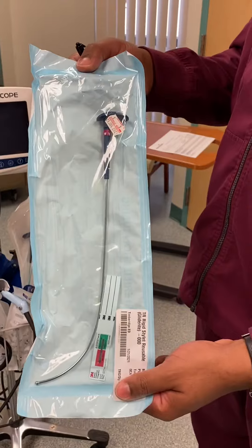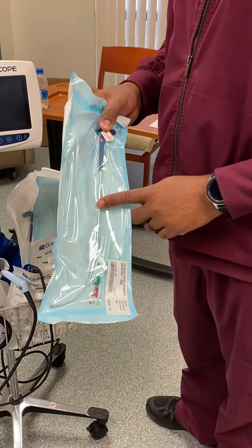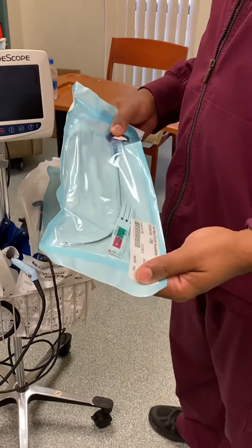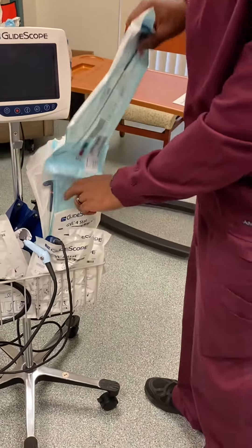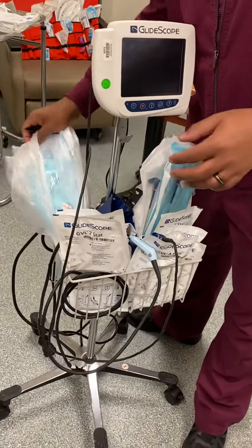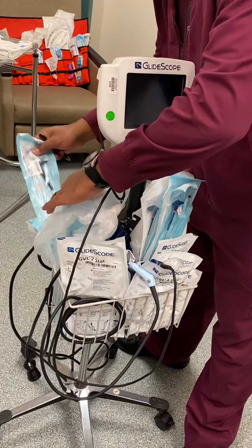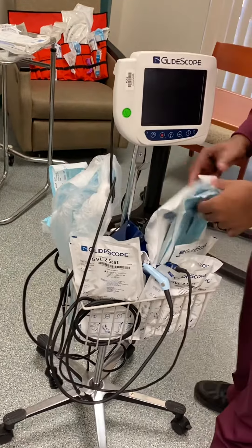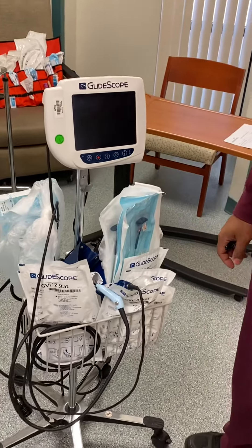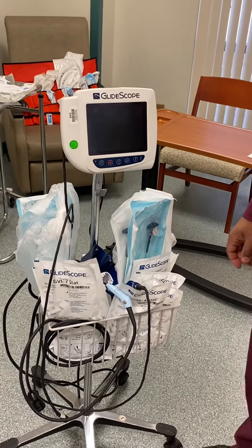And a stylet. This one goes into the tube — only the adult tubes though, not the pediatric. I'm not sure if we have a pediatric stylet, but I think we do. We don't have any on here, but we'll have to get some. And that is my demo. Thank you.